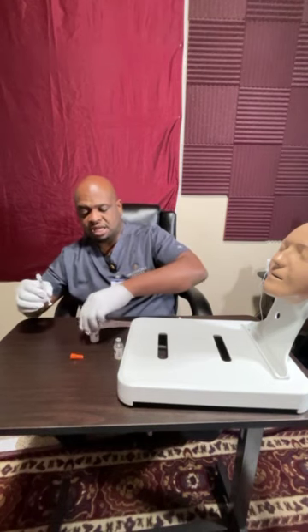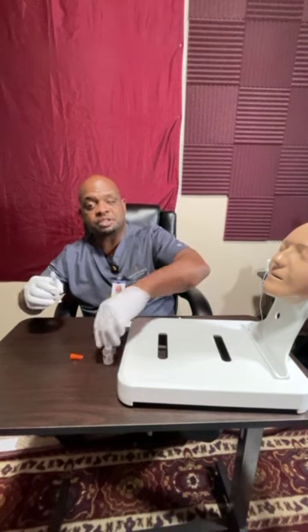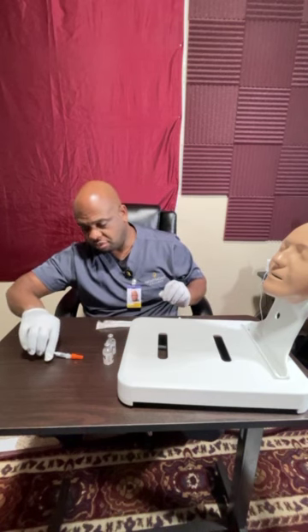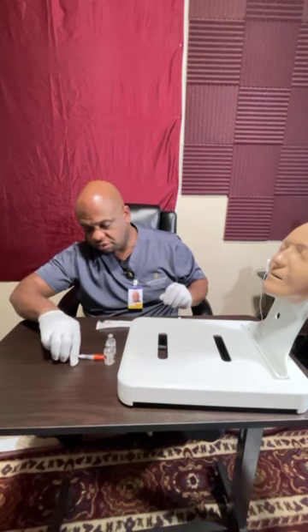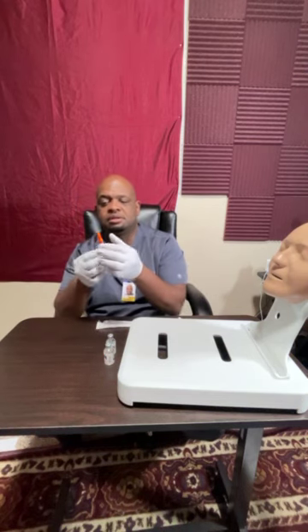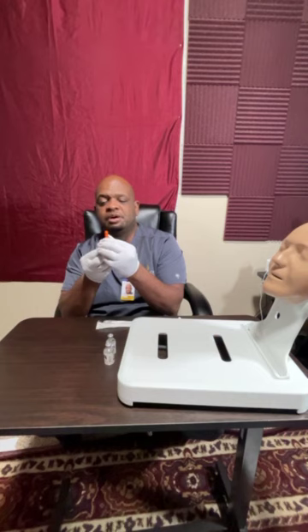And as I'm helping the patient get prepped to receive this, I am going to put the cap on it. We're going to use the one-hand scoop. And we're going to go there. There we are. I'm going to put this back on.